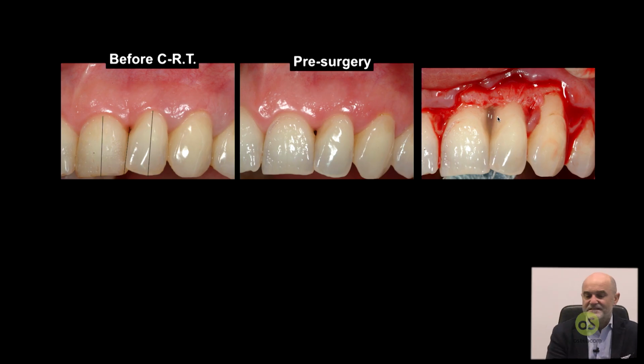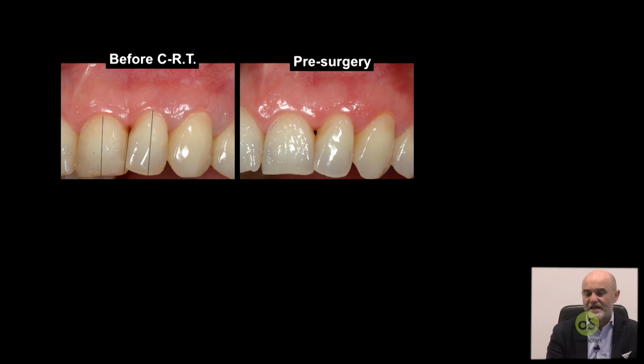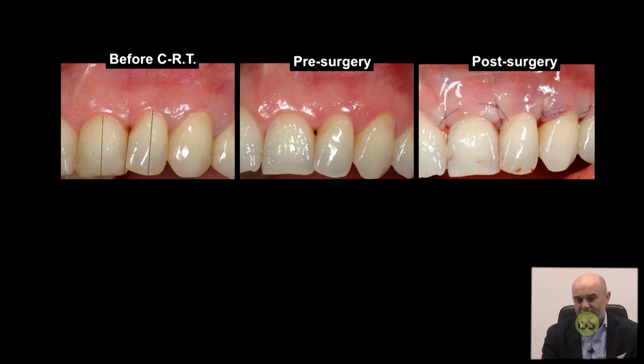So if the gel is too stable, it prevents the space from being occupied by the blood clot. So the gel must stay, let's say, 1 minute, locally applied, to give the gel the time to deposit the protein, and then you don't have to care about the gel, and you have to close.